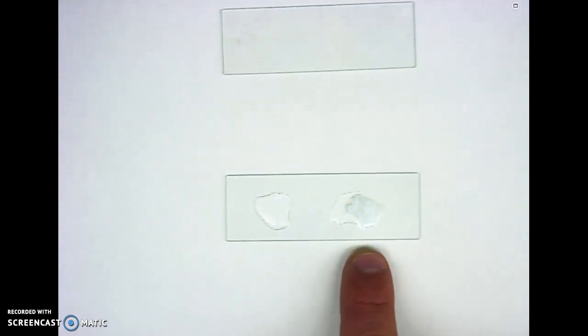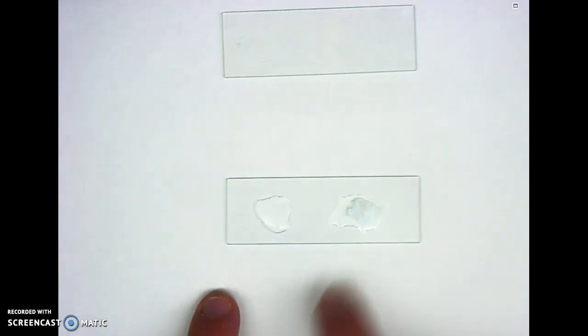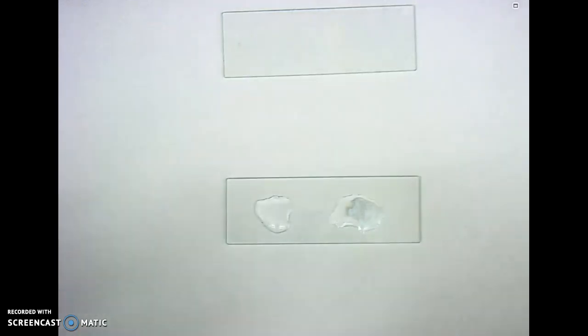So you have to refer to your notes as to what would cause a clot to occur when someone that has A blood gives to someone with B blood. That's not what we did here. We didn't give someone's blood type to another person. So it's a different way of thinking. You have to understand, using the same knowledge base of how blood-to-blood transfusions occur, how this lab simulated that.